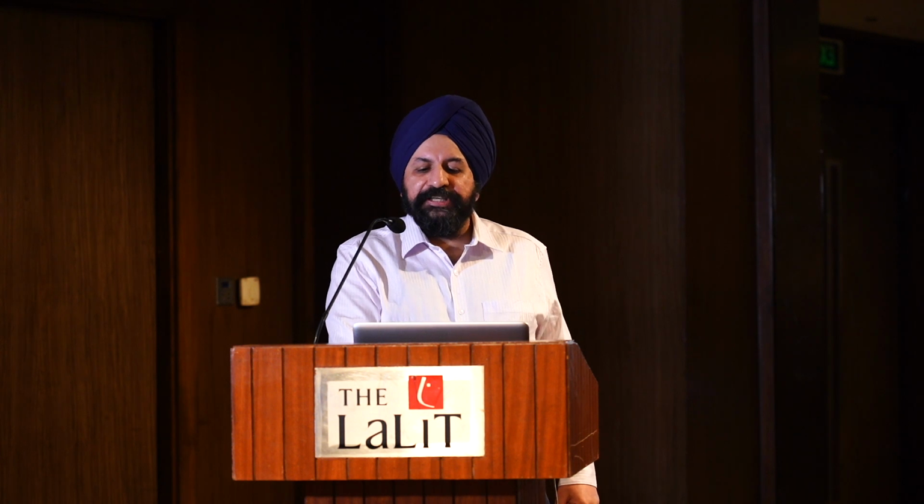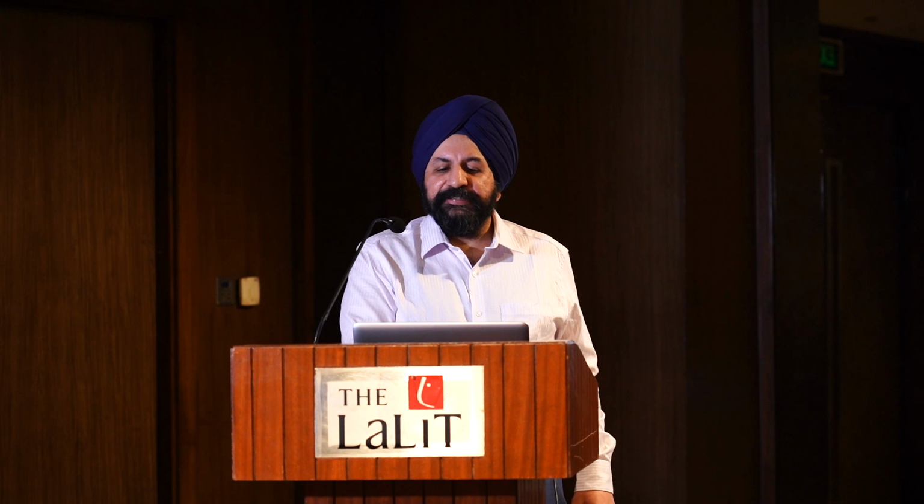So when you look at day 5, the HFC has already jumped 3 to 4 times. From 3.5 it has jumped to 12.6%, and the platelet count has further reduced to 38. Now this is my point from which I have to look for recovery. Now I should get my recovery by day 7, day 8. I am knowing that 2 to 3 days in advance. This is the same patient day 6, day 5 scattergram. You can see that the HFC has increased here.